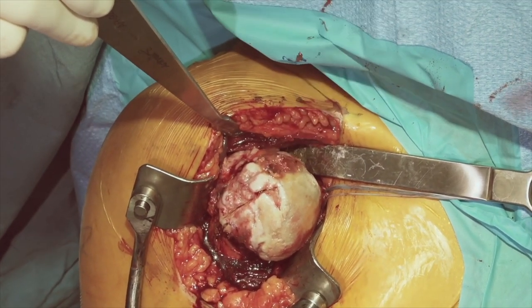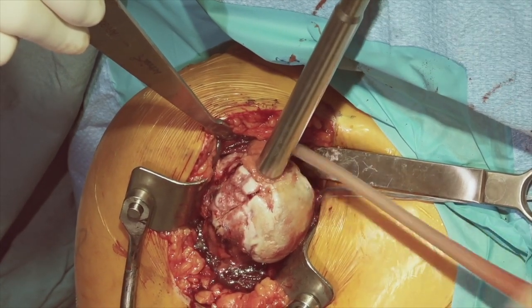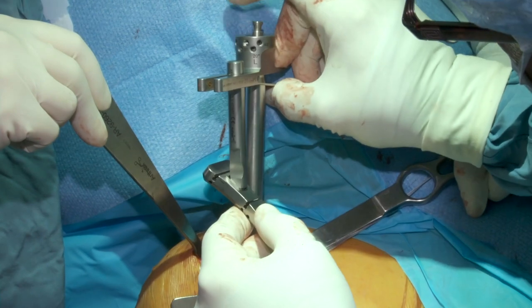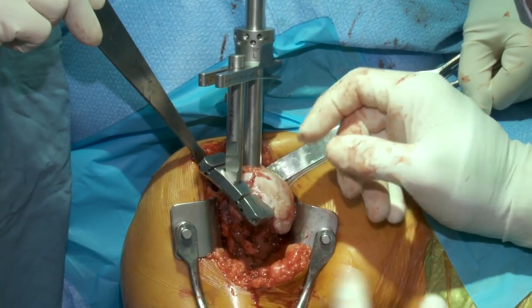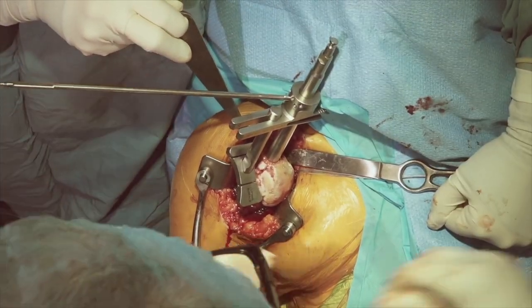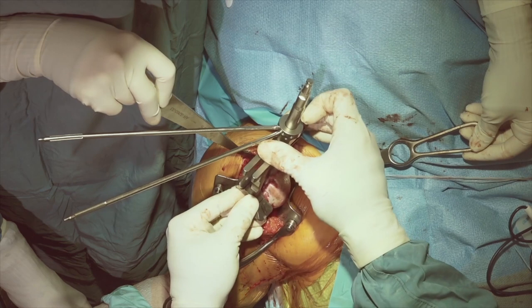We're going straight down the canal, feeling to make sure we're not pushing this in the wrong direction, and trying to identify the normal humeral axis. We'll try a size 6, and the 6 is going down readily. We'll leave the reamer in place and then use a guide system that allows us to identify the inclination we want — which in this patient will be 135 degrees — as well as the version and the height. We can do a relatively minimalistic cut on the humerus, especially in smaller patients, to try to maintain bone as much as possible. We'll put in a version guide rod — one at the 20-degree mark and one at the 40-degree mark — and keeping the forearm in position allows us to identify the best site for our retroversion.